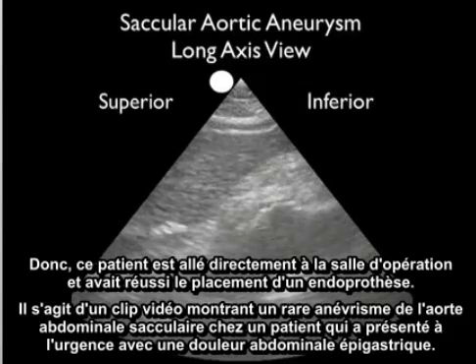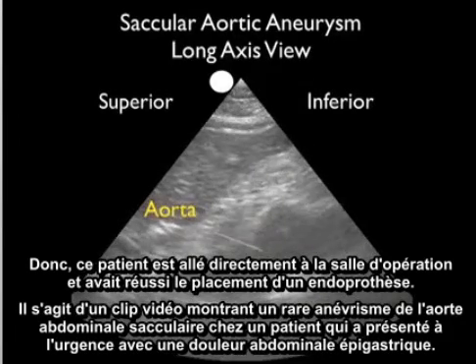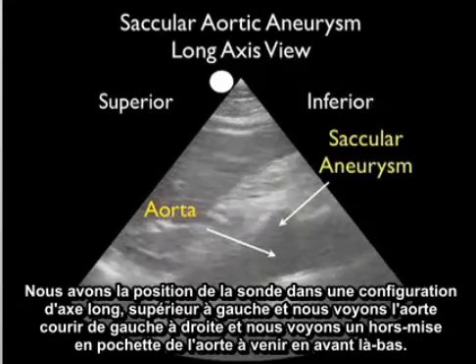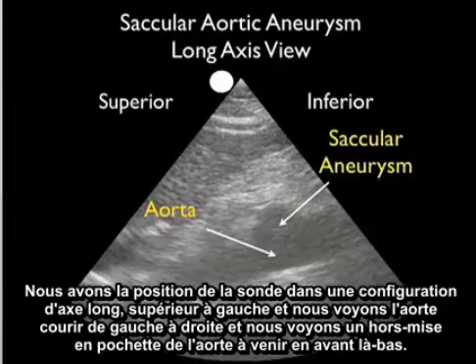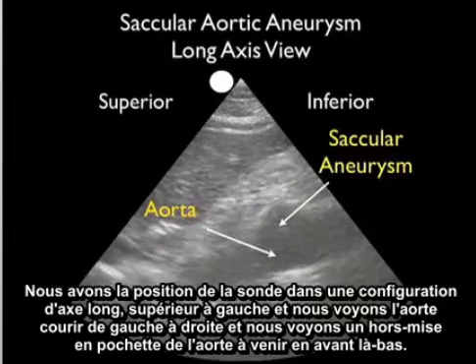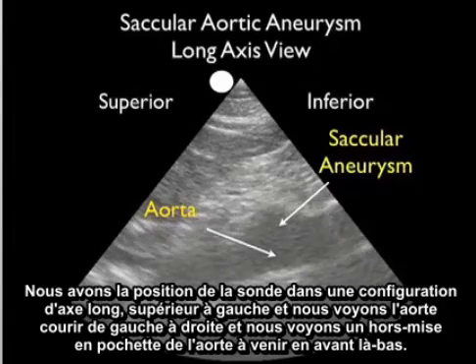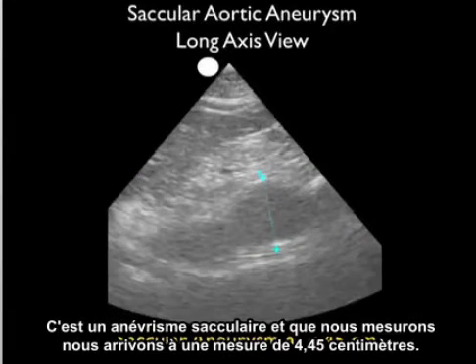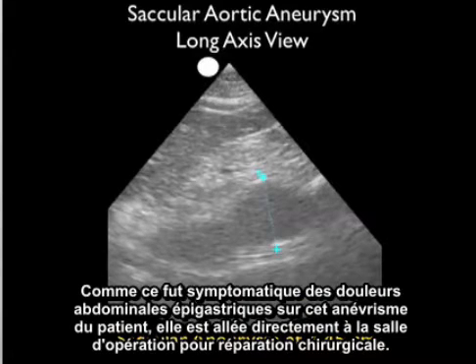This is a rare video clip showing a saccular abdominal aortic aneurysm in a patient who presented to the ED with epigastric abdominal pain. The probe is positioned in a long axis configuration, and we see the aorta running from left to right with an outpouching coming anteriorly — that's a saccular aneurysm — measuring 4.45 centimeters. As the patient was symptomatic with epigastric abdominal pain over this aneurysm, she went directly to the operating room for operative repair.